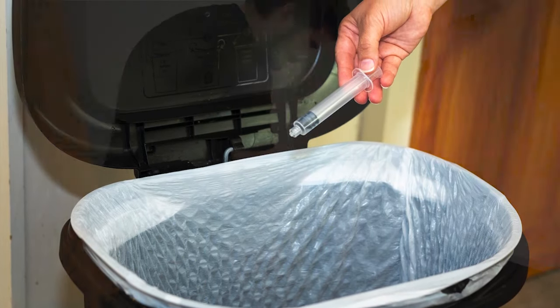The drainage bag may remain attached to the drain when emptying. You may not have to record the drainage amount from the bag. However, if your doctor tells you to record the drainage amount, hold the bag at eye level. Record the amount and the date.